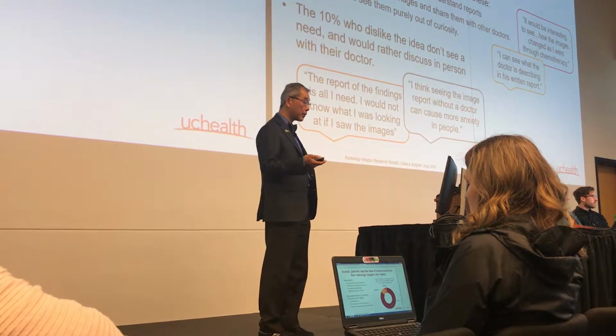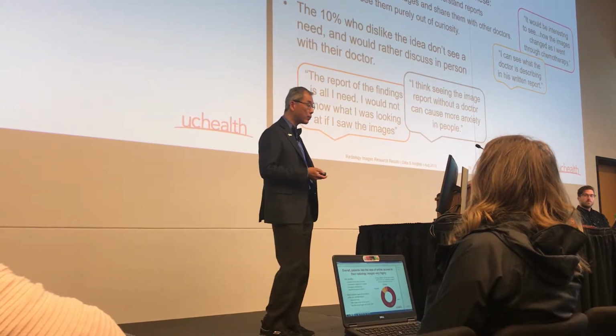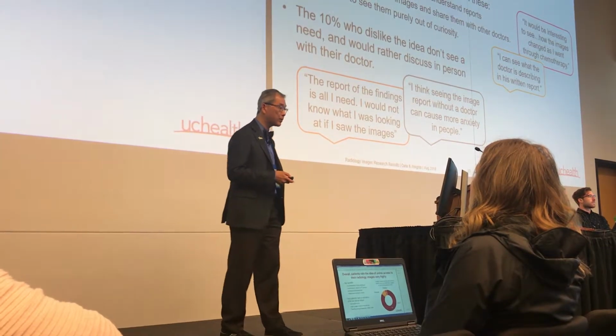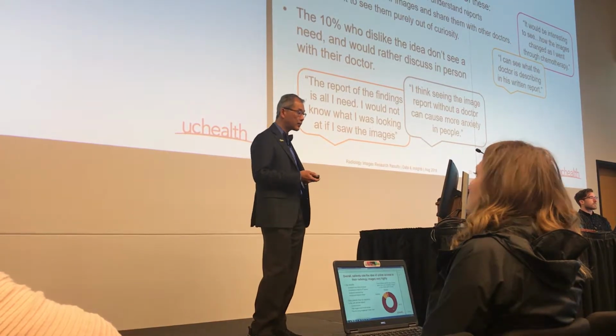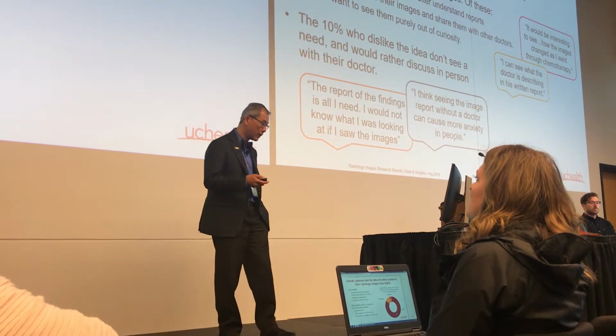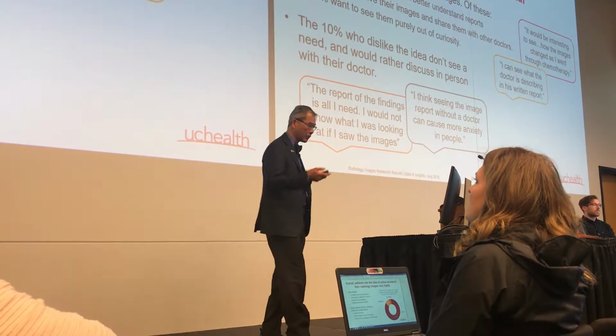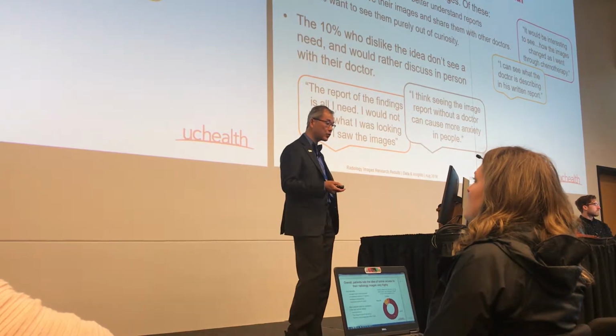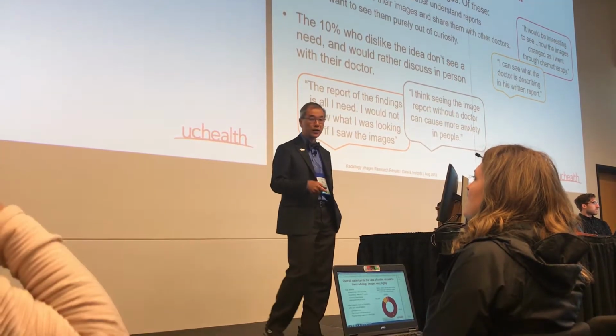35% say they would better understand the report. 29% want to save their images and share them with other doctors. 24% want to see them purely out of curiosity. The 10% who don't like it, don't see a need, and would rather discuss it in person. Quote, the report of the findings is all I need. I wouldn't know what I was looking at if I saw the images. Or, I think seeing the image without a doctor can cause more anxiety in some people.